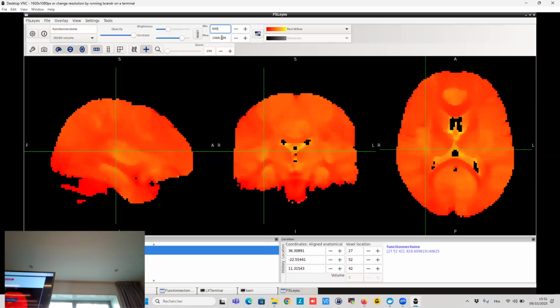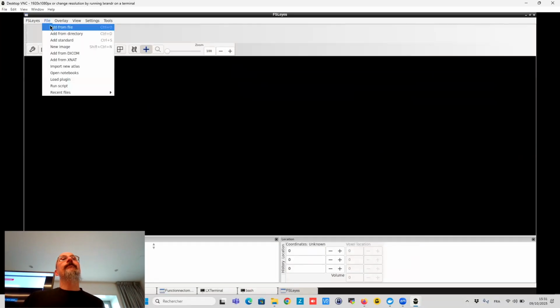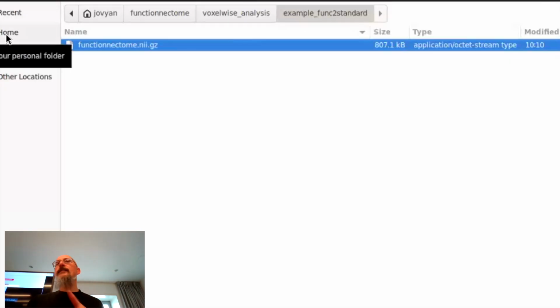So like that, you can avoid artifacts in the temporal region. You need to change the phase encoding, because if you do the phase encoding in the other direction, the artifact will be in the temporal region. If you are really interested in the temporal region, you need to change the direction. Maybe I can show you. It's standard to use this phase encoding, because people are not always interested in the temporal region.